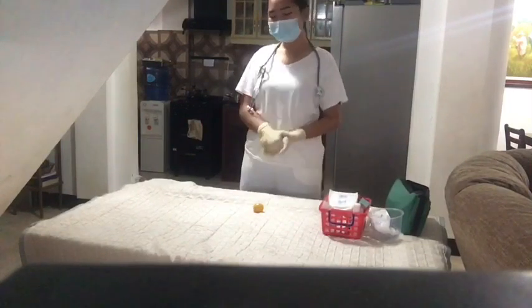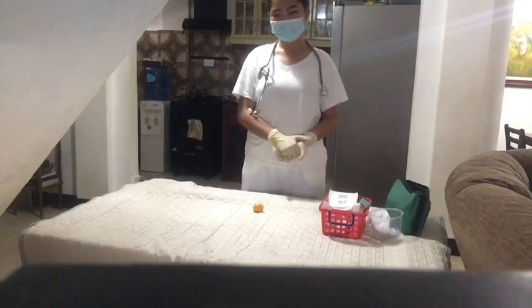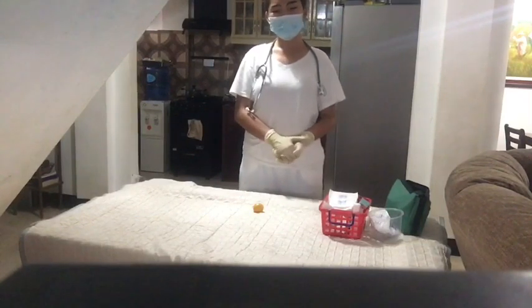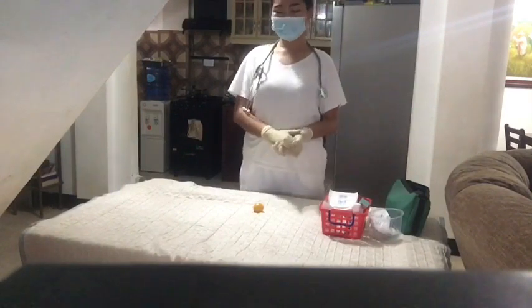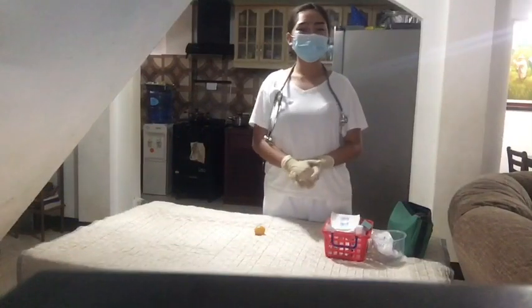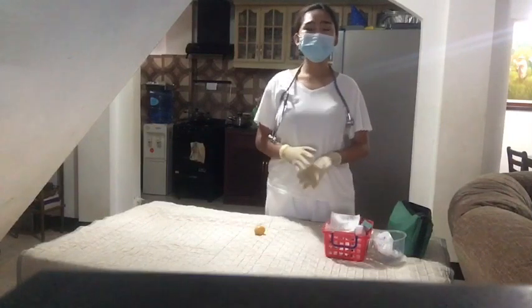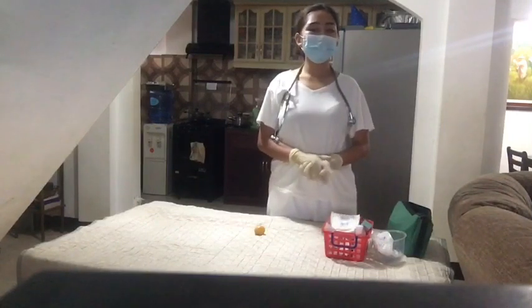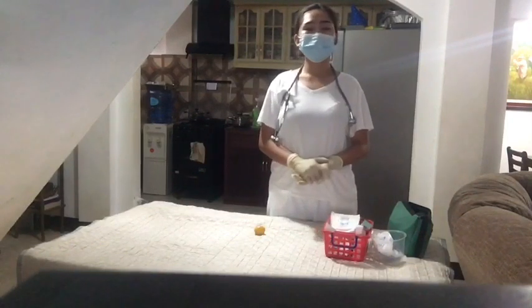Hi, Mr. Tomato. I am your student nurse for today, and I will be administering subcutaneous injection. Is that okay for you, sir? Okay. So, the next step is to assist the client to a comfortable position. This is to provide clear visualization and easier contact when administering subcutaneous injection.